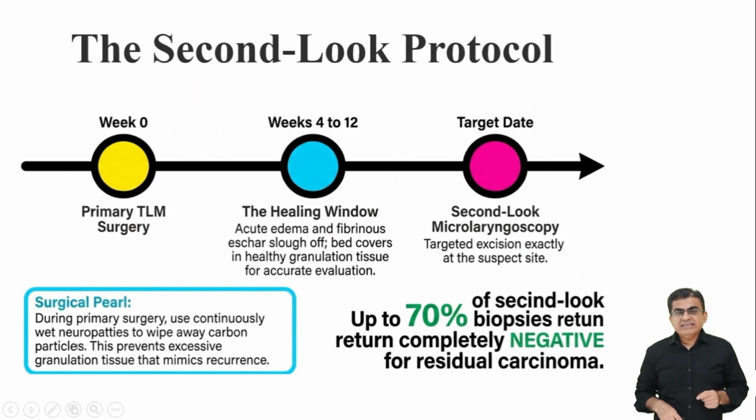Let us now look at exactly how we safely handle a positive margin report without automatically using radiation. Look at the clear timeline for the second look protocol. At week 0, you complete your primary laser surgery.